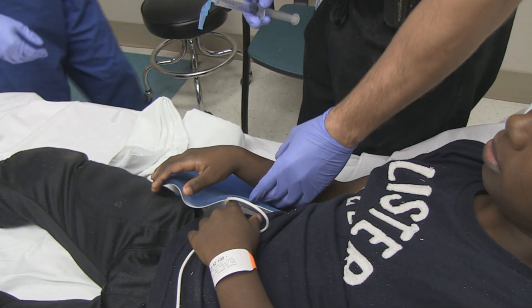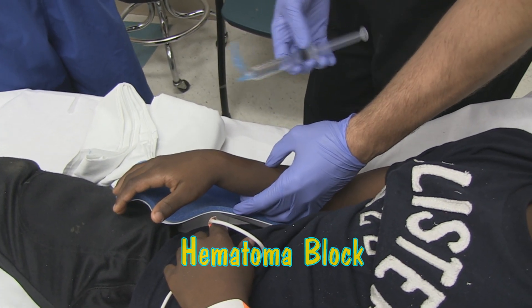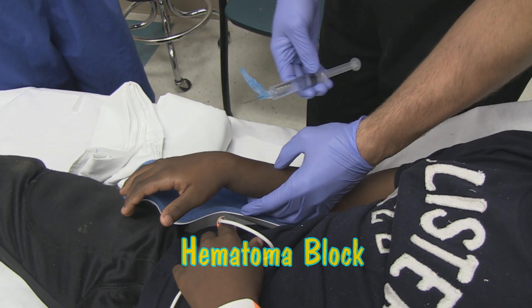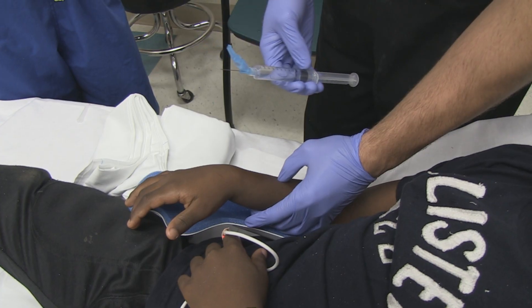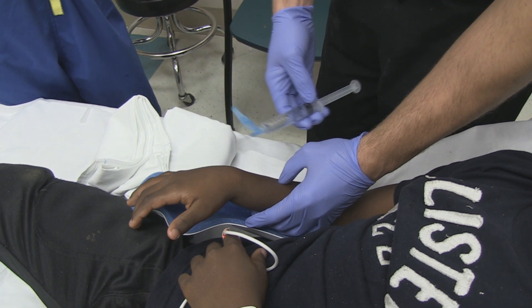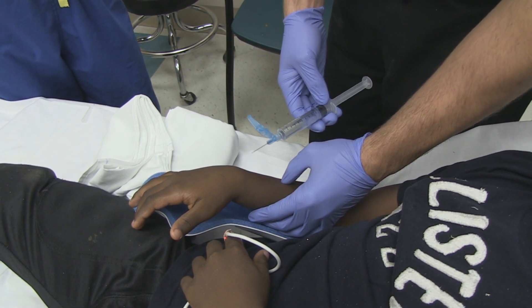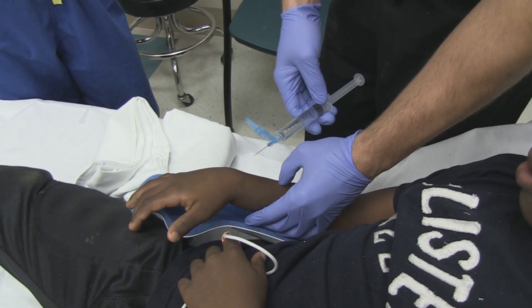So this is just a hematoma block for fracture reduction. Basic thing — just sterile prep it, and then a couple cc's of lidocaine is fine. Things to remember with the wrist joint: it's usually always a little more proximal than you anticipate, so most people tend to go too distal. Err on the side of more proximal and you'll usually find it okay. You should get a good drawback of hematoma to let you know you're in the right spot.